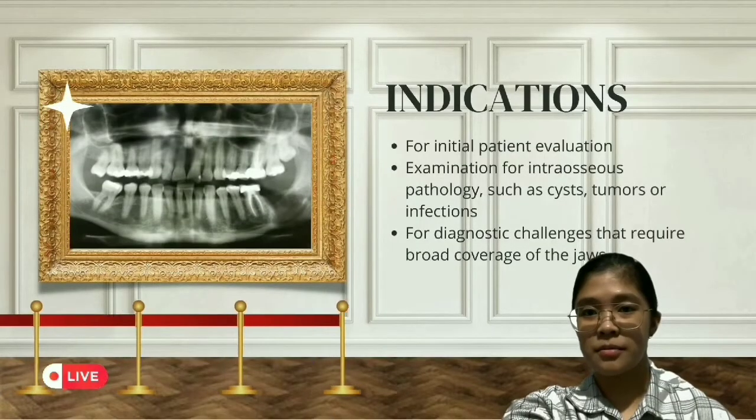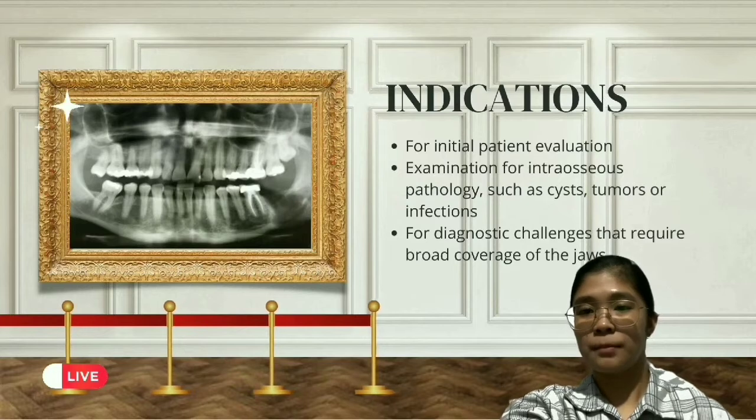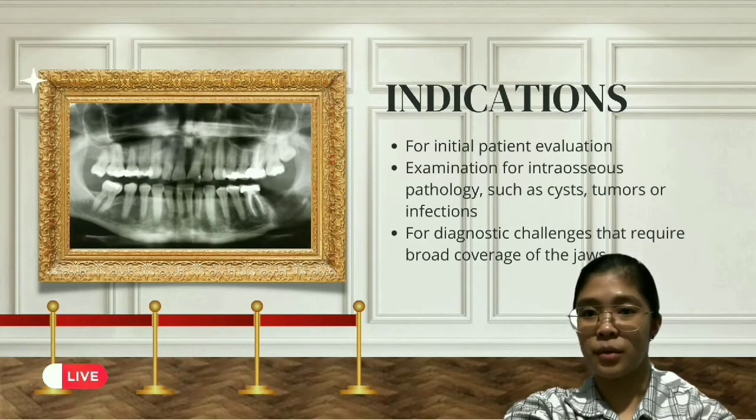Let's discuss some of the indications of panoramic radiography. Number 1 is for initial patient evaluation, for example, identifying the impacted third molars when a consideration needs to be given whether or not it should be removed.